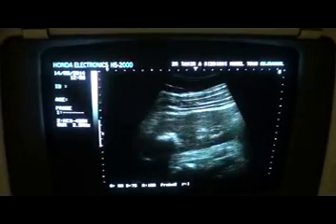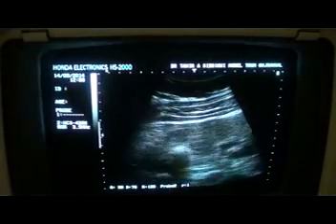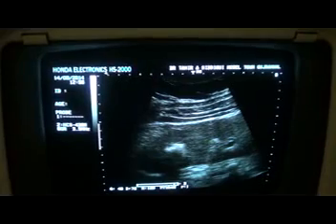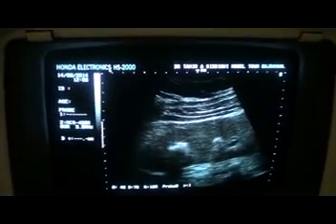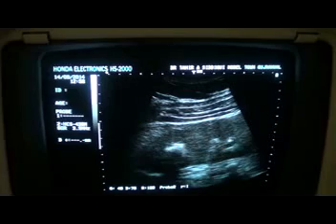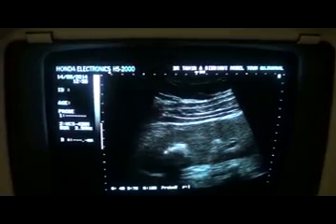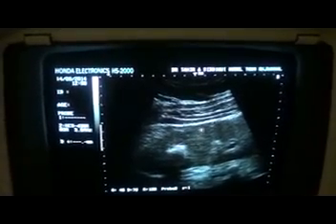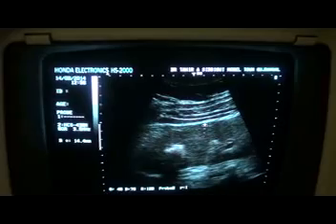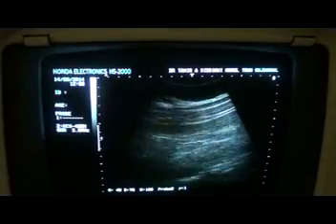So it does show muffling of the central sinus echo complex, and there are a few tiny concretions also seen in the lower pole. This is a small concretion. In the lower pole, it is minimally dilated lower pole calyx. These are the calculi that are gathered together in the upper pole calyces. Muffling of the corticomedullary differentiation with almost preserved cortical thickness and intact parenchymal echogenicity.